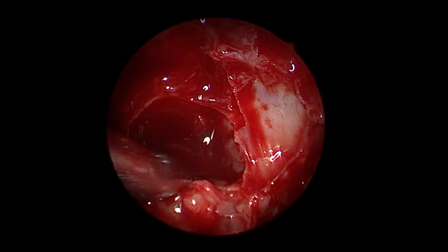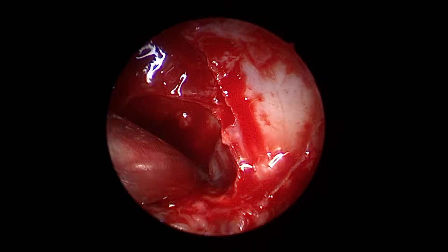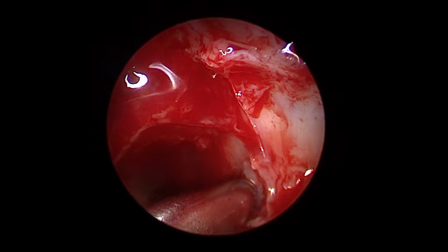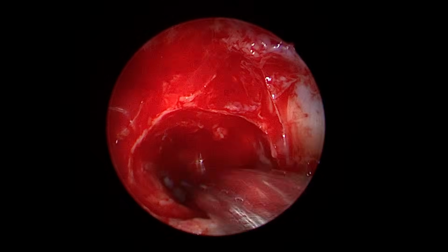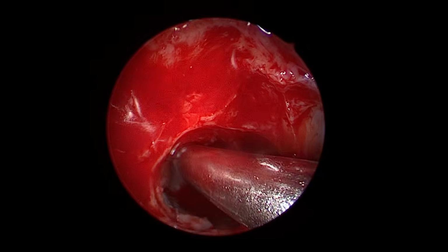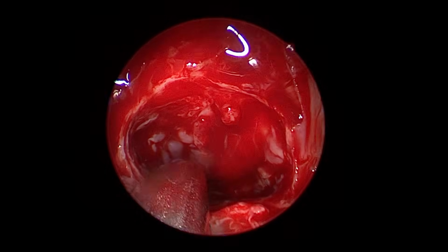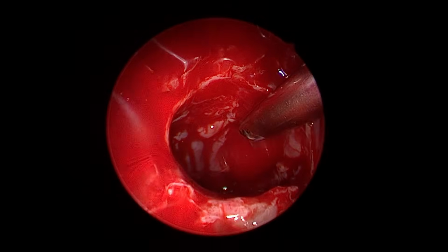See, this is called adequate widening of the sphenoid, so that the whole side things get access. The same thing you said, to give access to the topicals adequately. Marocell.